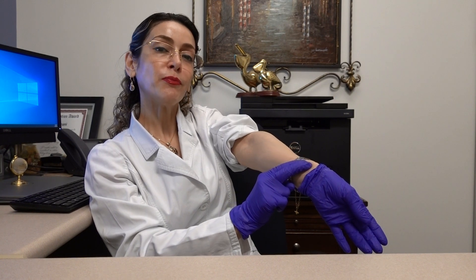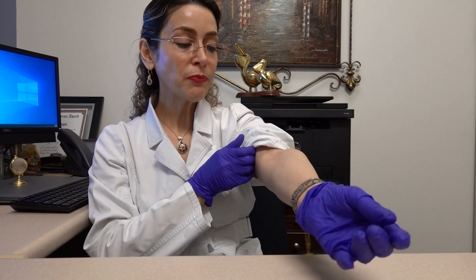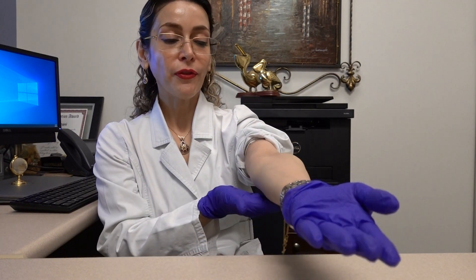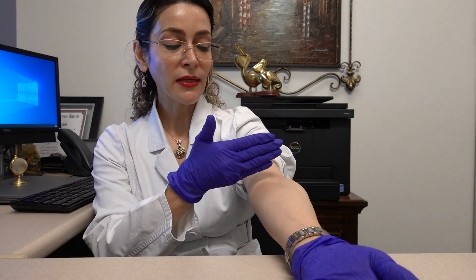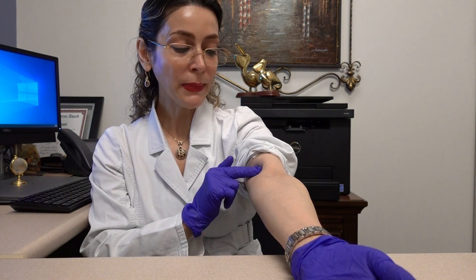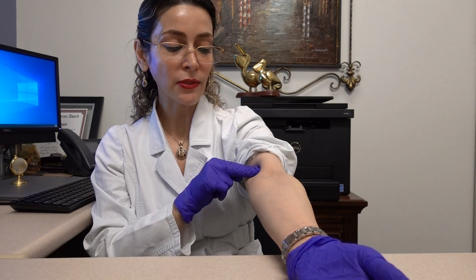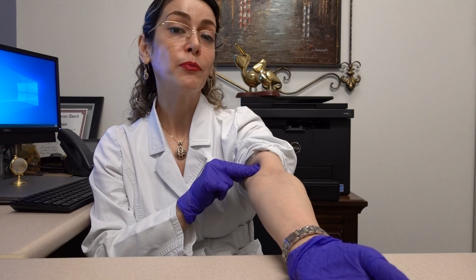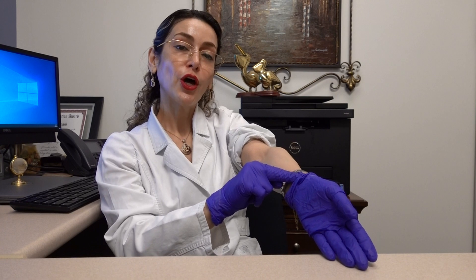If you count the number of pulses in one minute, that would be your heart rate. Another common place would be the brachial pulse, which is very important especially when we take blood pressure. The hand of that individual should be at rest. Then, above the elbow, you press medial to biceps brachii — that muscle is biceps brachii — medial to that you press and detect the brachial pulse. Brachial pulse and radial pulse are very important.